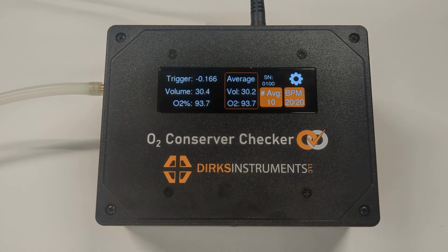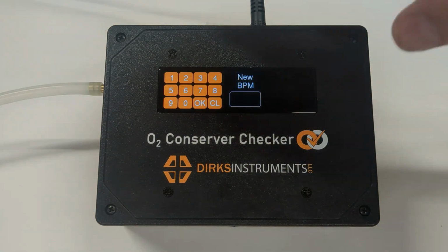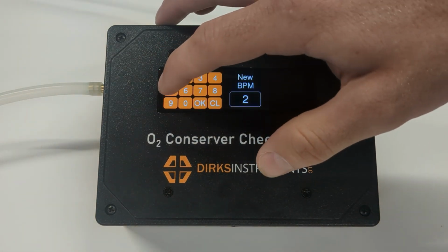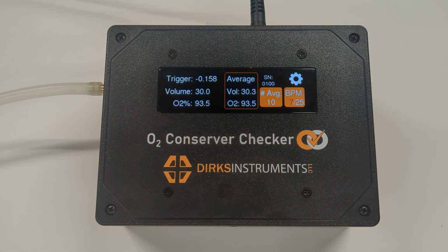Next to the average values, we have the breath rate display. The breath rate can be adjusted by clicking the BPM button. This can be set from 10 to 40 breaths per minute. Our breath rate box has two values: the target breath rate that the device is triggering at on the right side, and on the left side is the actual measured breath rate. If this breath rate is more than 1.5 breaths per minute off from the set breath rate, the text will be displayed in a dark red.